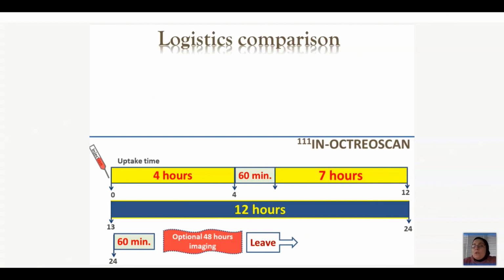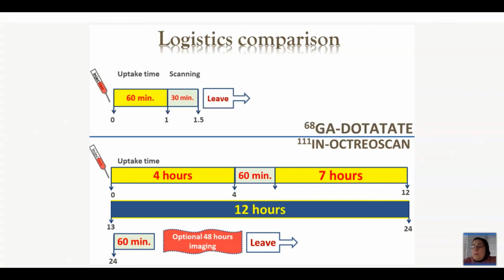When we talk about dotatate, on the other hand, the patient gets the radiopharmaceutical, stays with us for 1 hour, has 30 minutes of imaging, and he's done. So it's an hour and a half, 2 hours at most, between the registration and bringing the patient in, not more than that. So even logistically, it's much better, much easier for the patient.